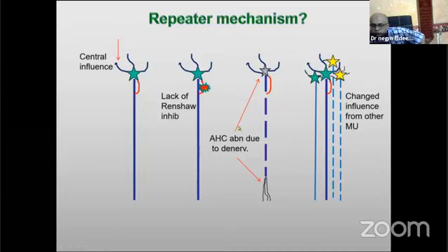Another thing is that if we have a loss of axons, we have a retrograde change in the anatomy and physiology of the motor neuron, and we get a phase of hyperexcitability that theoretically should be able to cause the repeater F wave. I draw that conclusion on the basis of the fact that so many patients with repeater F wave have some kind of axonal loss.